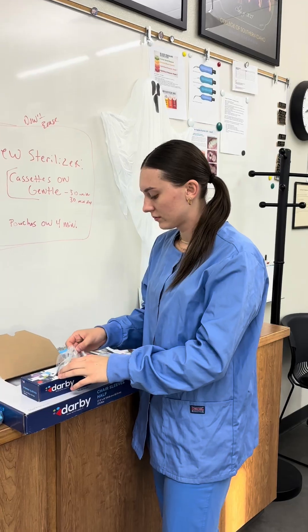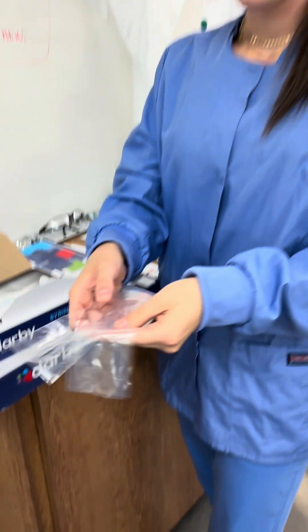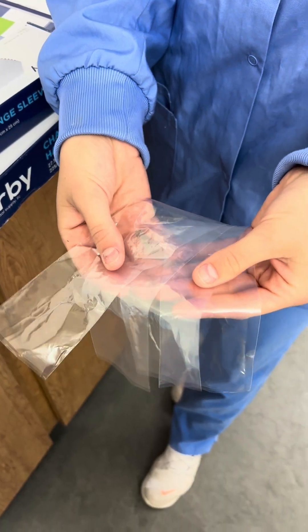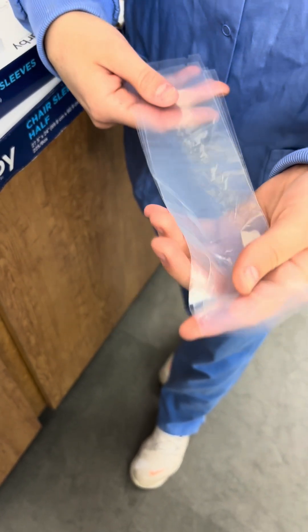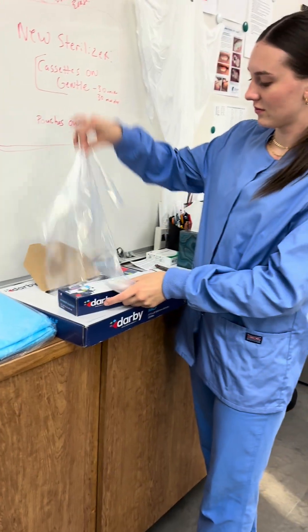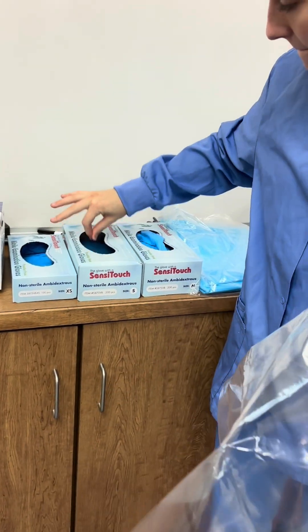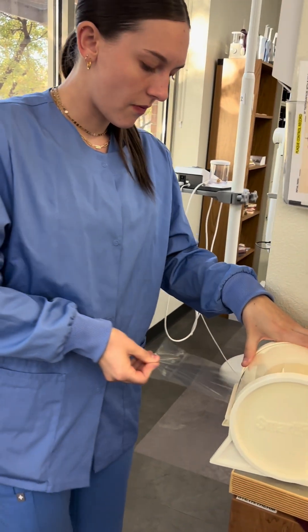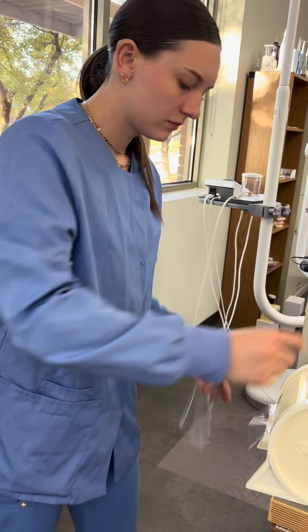This is Ellie and she's going to grab the barriers: four barriers for the light, the saliva ejector, the high vac, and the air-water syringe. One for the chair and a pair of gloves. And she's going to get barriers for both screens and the mouse.